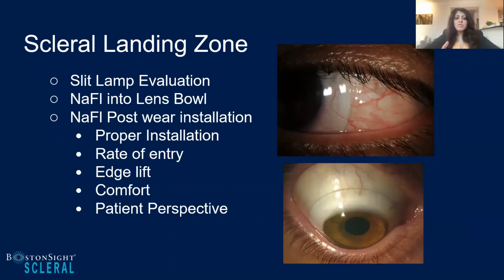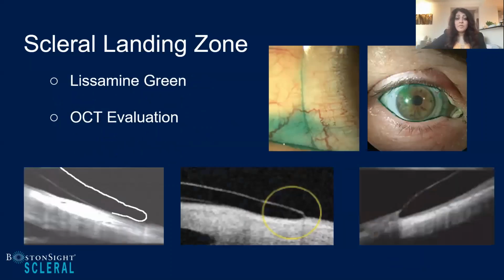The purpose of doing this is for you to be able to see the edge of the lens and see how fluid is moving in. How is that sodium fluorescein moving under the lens? Is it getting under at all? How high is that edge? And you get to see the rate of exchange that's taking place. Both having that fluorescein in the bowl versus putting it in afterwards are going to give you two totally different pieces of information. And I think both of those pieces are really important when you're evaluating the scleral edge.